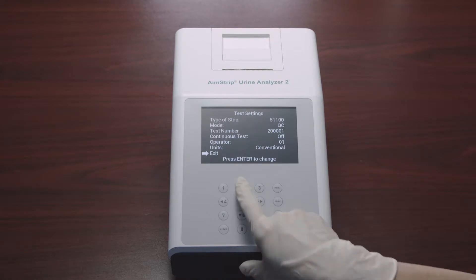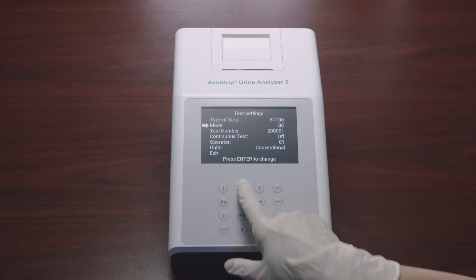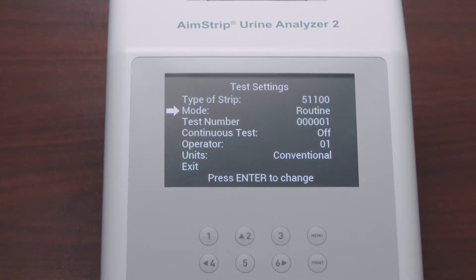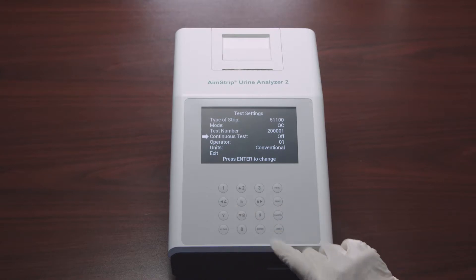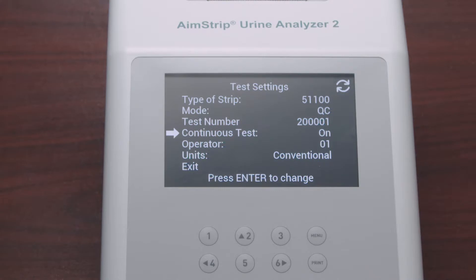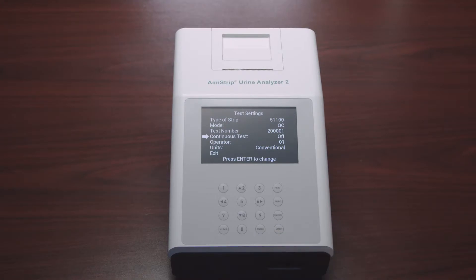The first digit of the test number depends on the test mode: zero for Routine, one for Stat, and two for QC test. This first digit is fixed and cannot be changed. Next in the test settings, after test number, is Continuous Test. Select Continuous Test and press Enter to cycle the setting to Off or On.